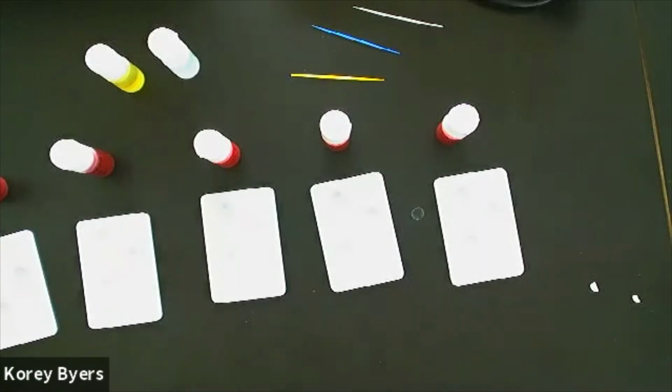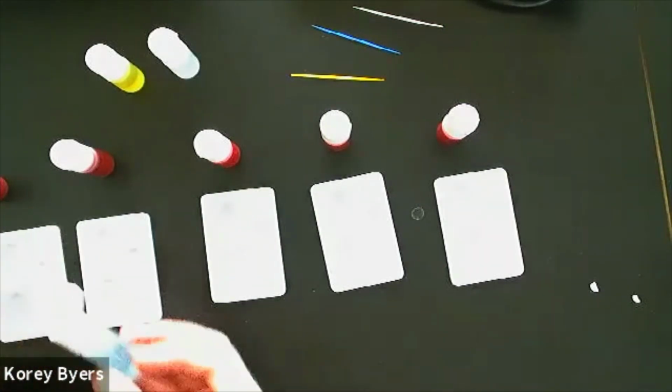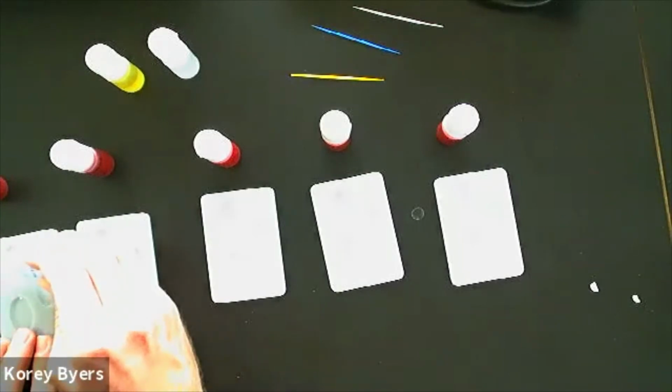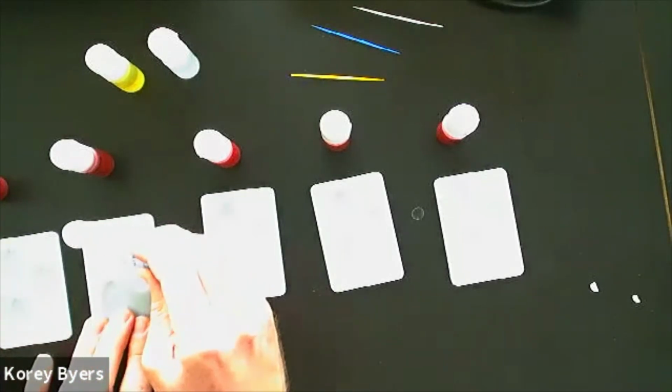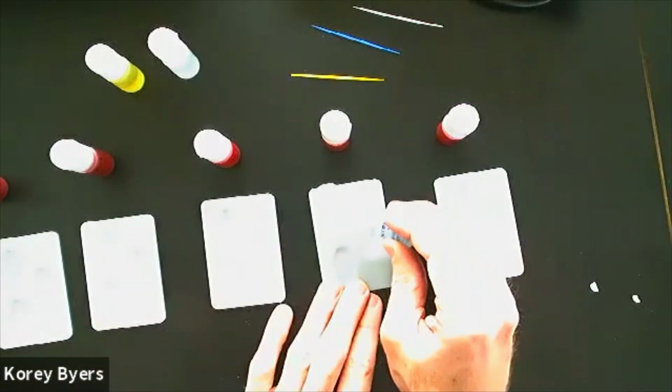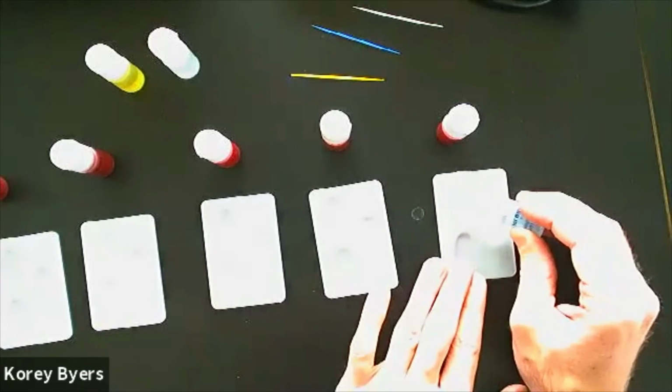So I'm going to do the first one together with you, because sometimes these blood types, they need a second. So what we're going to do is take our antibody A, the blue one, and we'll put 1 drop, so all you need is 1 drop, in the A well. I like to set all of mine up at the same time. You can do it one at a time, or just go through and put a drop in each of the A wells.